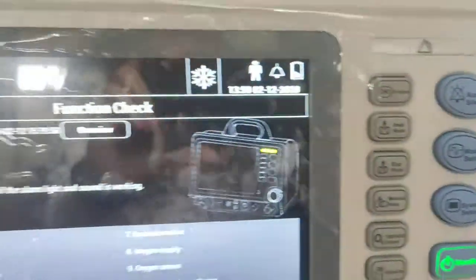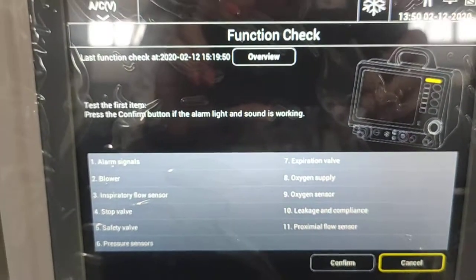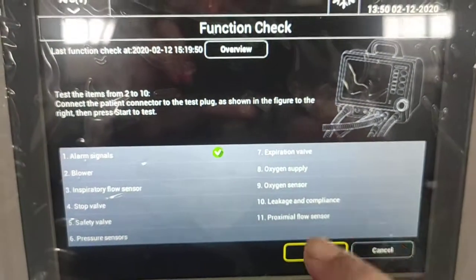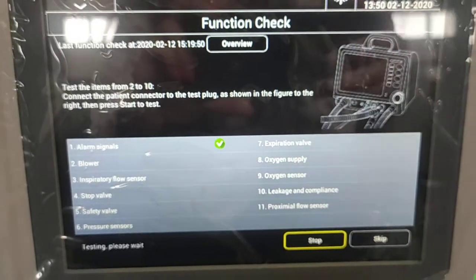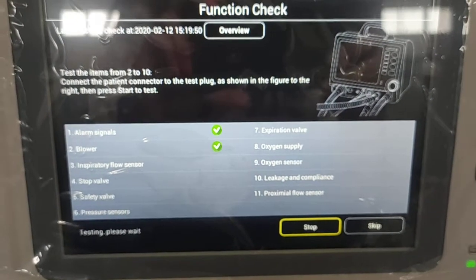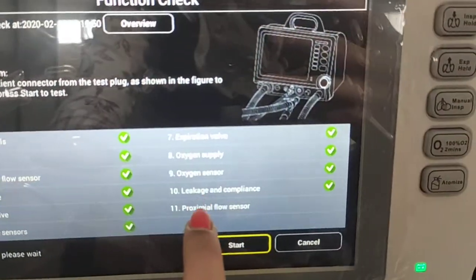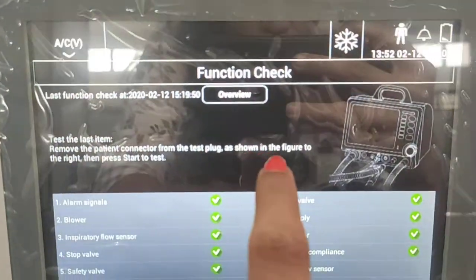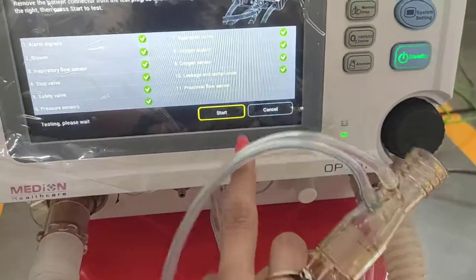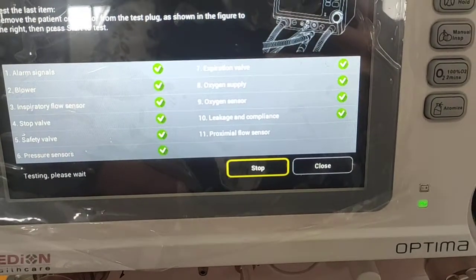Before starting the test, a message will appear asking you to confirm if the alarm LED and sound are working. The alarm LED is glowing and the sound can be heard, so confirm it first and then start the test — it will start automatically. Once completed, for the proximal flow sensor test, remove the flow sensor, keep it in air, and start the test.